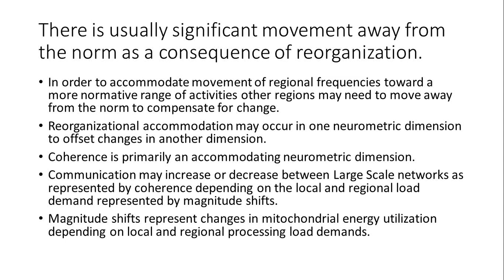With people who are disordered, those patterns can become rigid and fixed. People may become more oriented towards the default mode system, less oriented towards the external attention system. And so there may be compensatory processes in coherence and connectivity to accommodate that more rigid and fixed pattern. And that's why you see those changes in coherence.